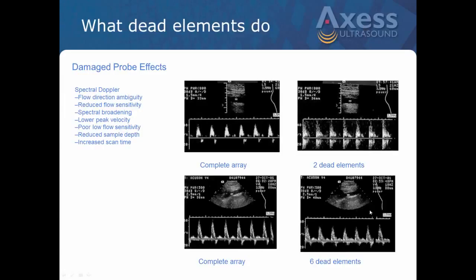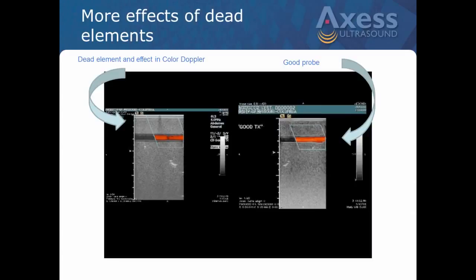That's a physician, a vascular surgeon, a radiologist looking at that, a cardiologist is going to say, "Ooh, we have a problem here." So it's going to require further tests, further inconvenience, and pain to the patient, cost, etc. Now here, we're looking down in the abdomen. Again, we've got a normal Doppler flow.